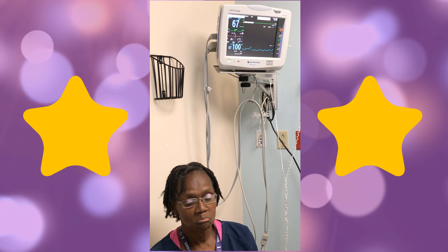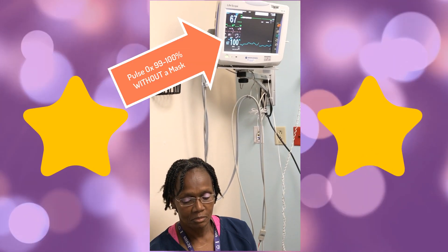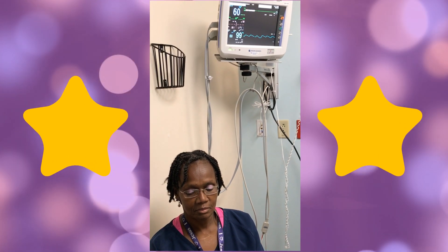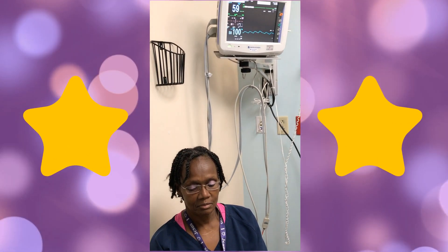Her pulse ox without a mask is 99 to 100% O2 saturation. Now we're going to try putting a mask on.